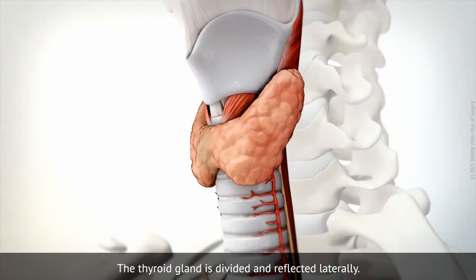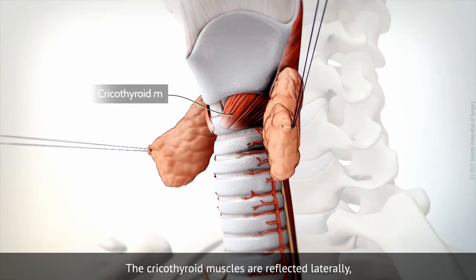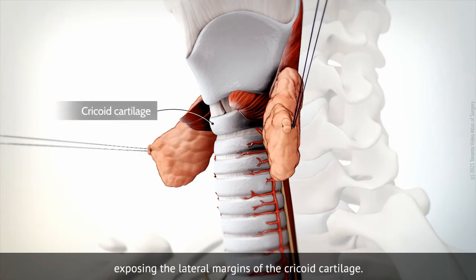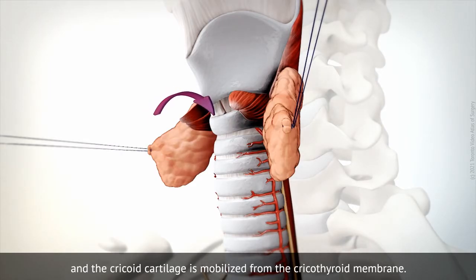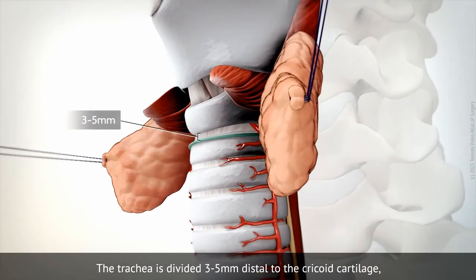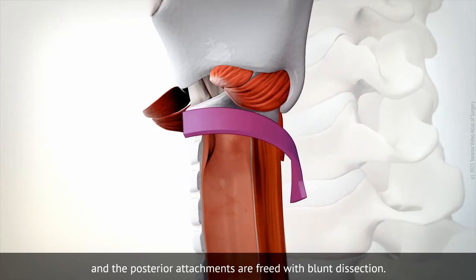The thyroid gland is divided and reflected laterally. The cricothyroid muscles are reflected laterally, exposing the lateral margins of the cricoid cartilage. The cricoid cartilage is mobilized from the cricothyroid membrane. The trachea is divided 3 to 5 mm distal to the cricoid cartilage, and the posterior attachments are freed with blunt dissection.